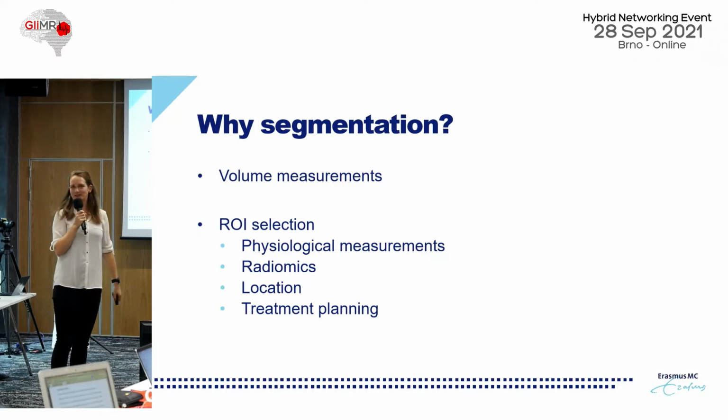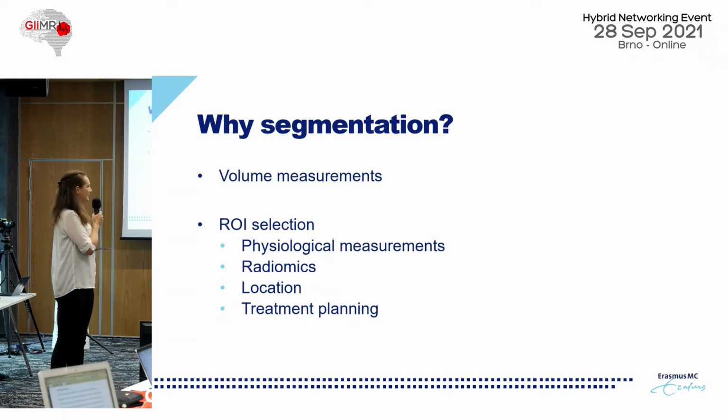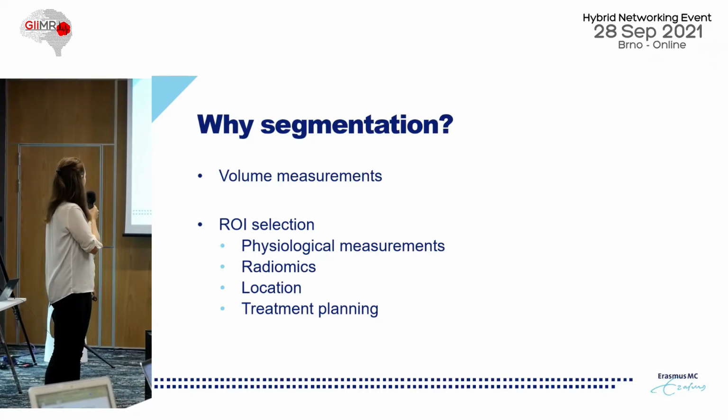So why do we need segmentation? Maybe this is a trivial question, but I think you can separate basically two purposes: volume measurements or region of interest selection. And based on what you want, you might have different methods that you want to use.